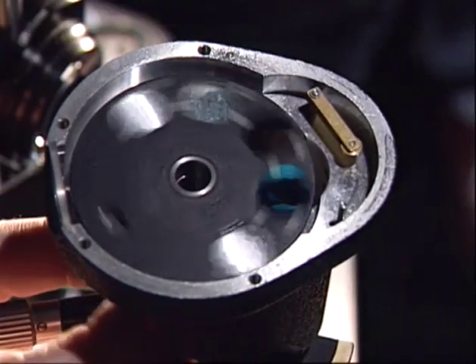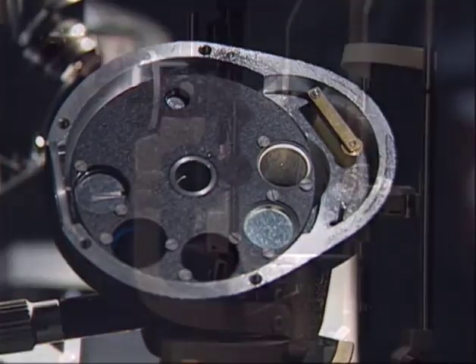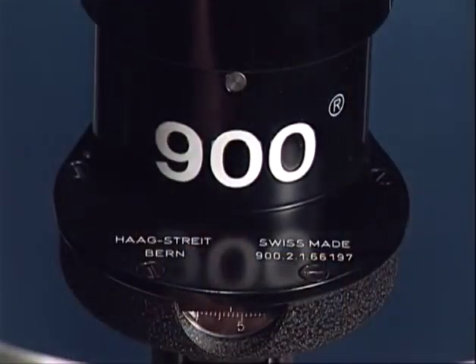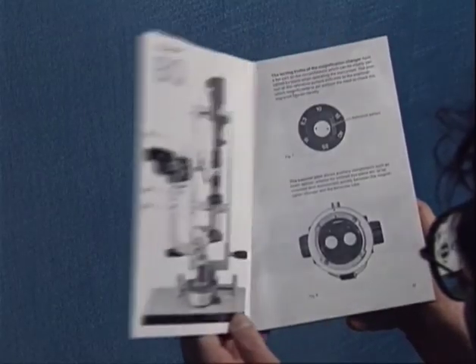This tape shows the practical handling of a slit lamp by the example of the Model 900 BQ Haag-Streit. For details, please refer to the manual of your personal slit lamp.